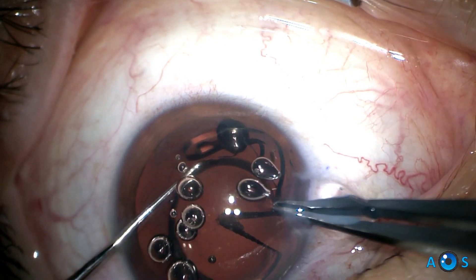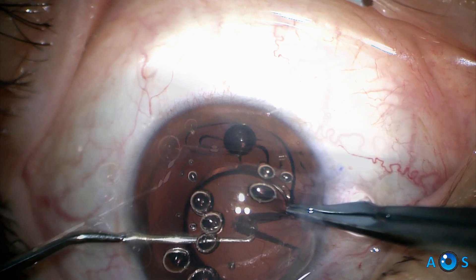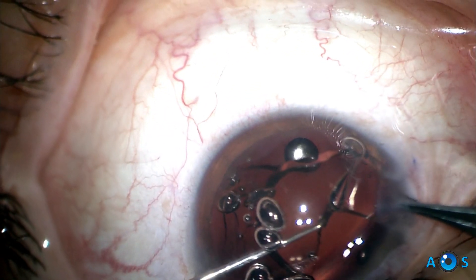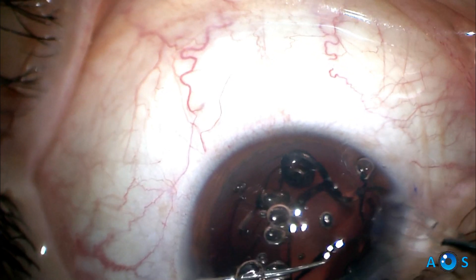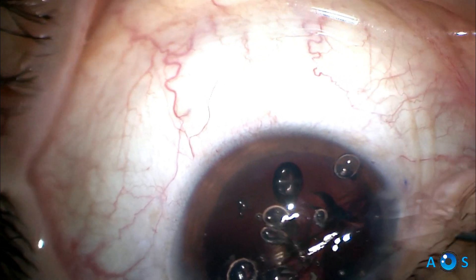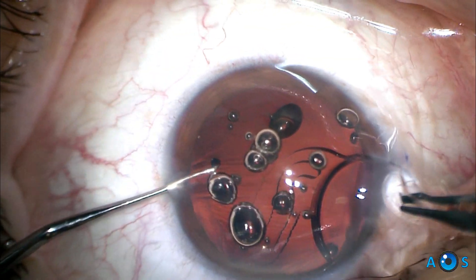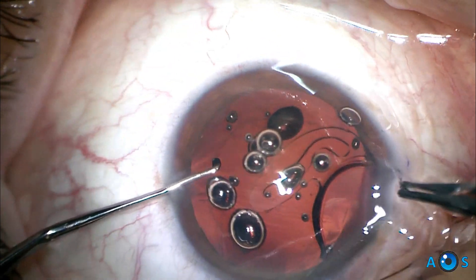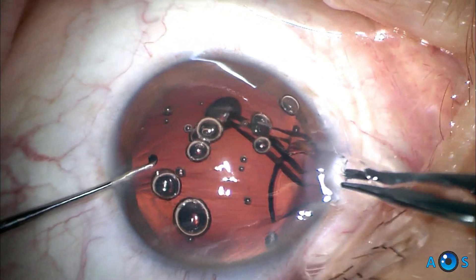The bigger the slice, the easier the next step will be, but you will notice how efficient this technique is even in a lens with such large haptics and overall diameter. A toothed forceps is used to grab an edge of the IOL optic. Then the lens is pulled towards the corneal incision and controlled pulling and rotating movements are repeated. Only a few attempts are required until the IOL rolls out of the anterior chamber, exiting through the corneal incision.